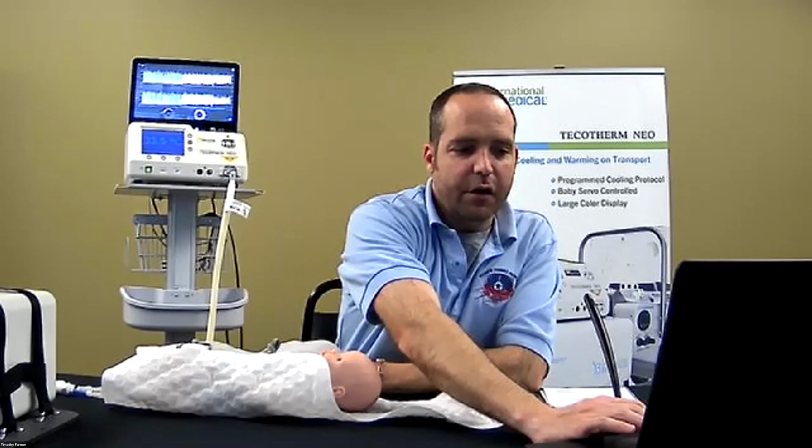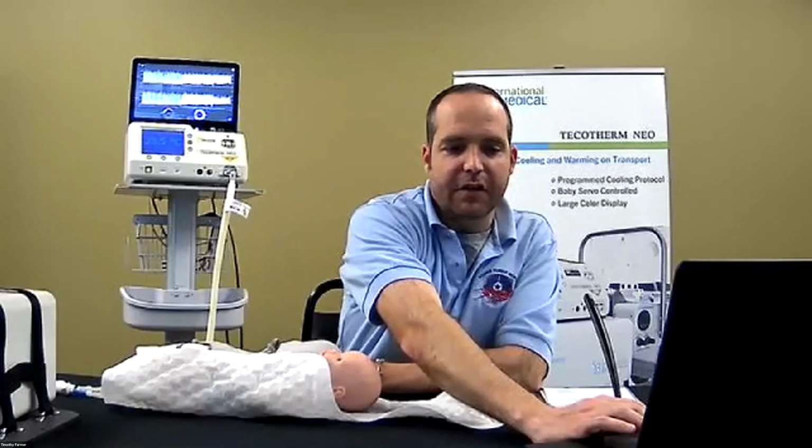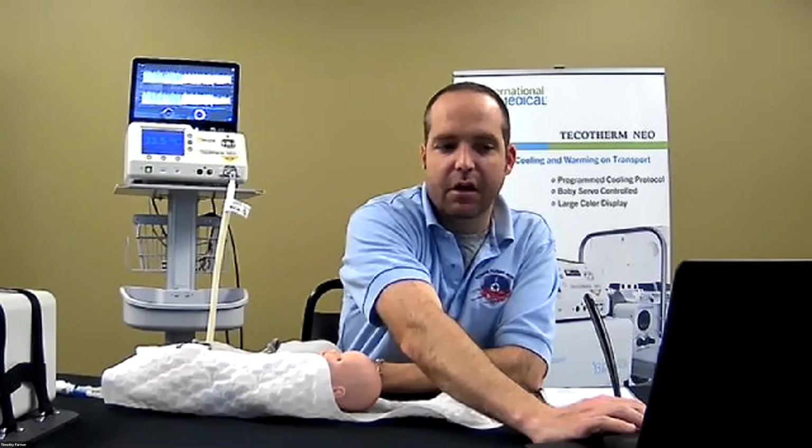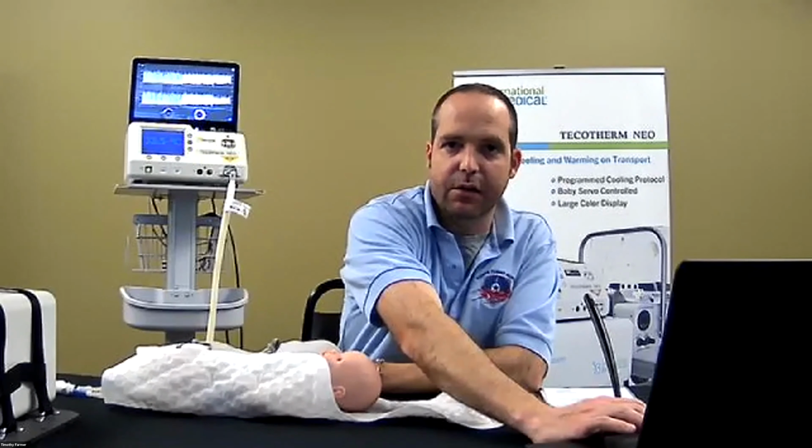So Tim, they're asking, can they use Tecotherm with esophageal probes, or is it only rectal? Well, we use ours with rectal, but we have also transported with esophageal probes to compare it. That's been our experience. There's also the ability to put on a skin temp monitor as well. But from my understanding, from my use, it's been servoed off the core temp from rectal.